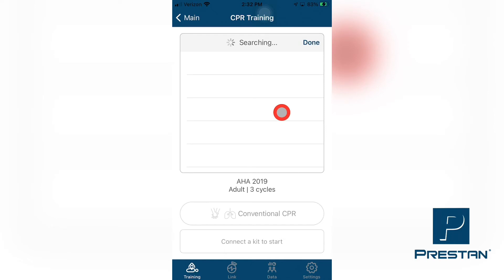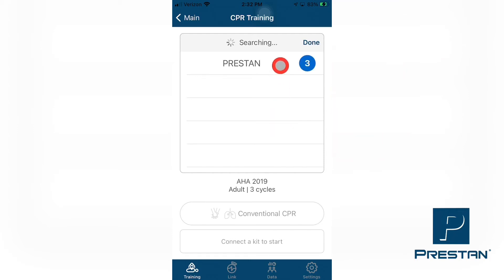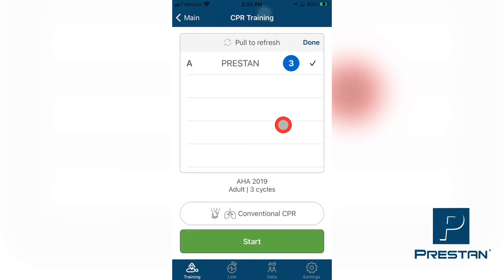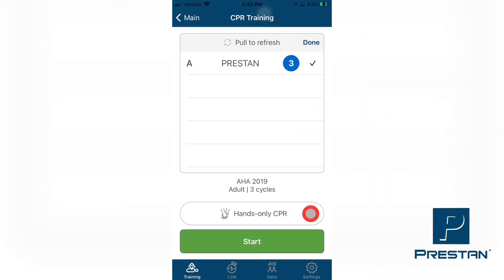You will now see that your device is searching for any active Preston Adult Professional Series 2000 mannequins that are in your immediate vicinity. Once the list of mannequins appears, select the mannequins from this list that you wish to connect to. When the mannequin is connected, you will see a checkmark appear on the line next to the selected mannequin. Once all the mannequins are connected, you can select your desired training method. The available selections are Hands Only, which is the method where the students will perform compressions only, no ventilations, or Conventional CPR, where the students will perform both compressions and ventilations in combination.